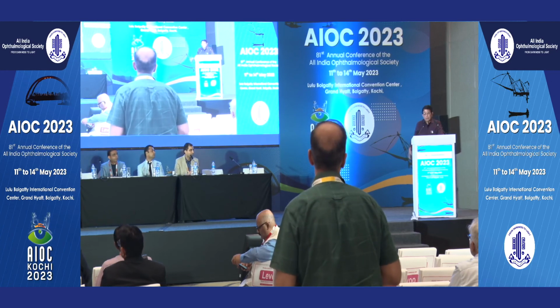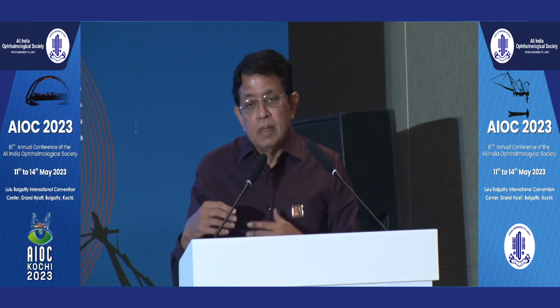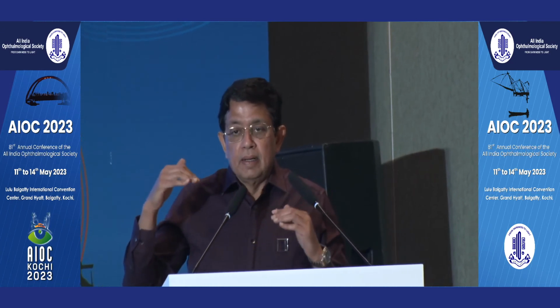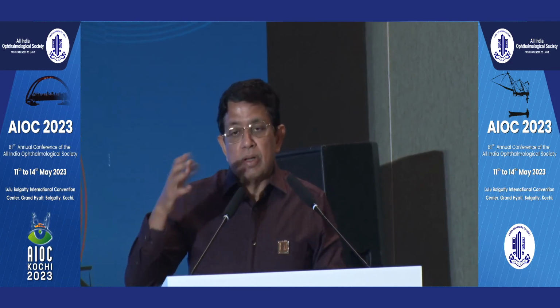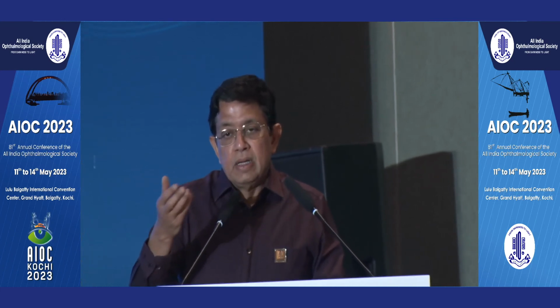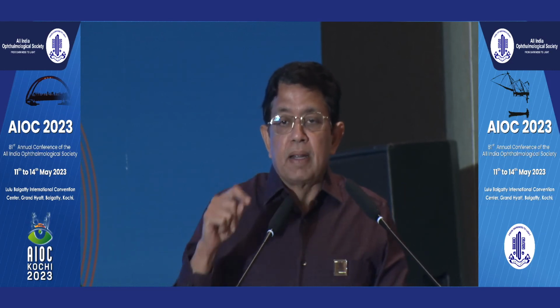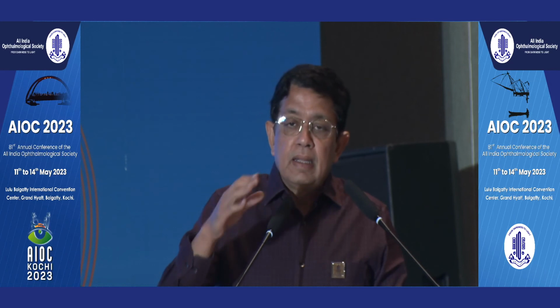No, you should definitely re-rotate them back, especially if it's a single piece lens with not a plate haptic design. In these lenses, some of them have toricity on the anterior surface, and the multifocality is on the posterior surface. It's extremely important to reverse the lenses back. But if it is a plate haptic lens, which are planar lenses, then there is no need for rotation because they are bitoric.